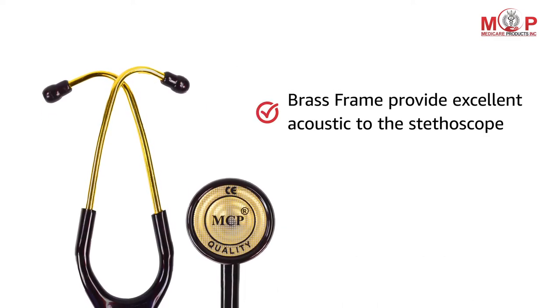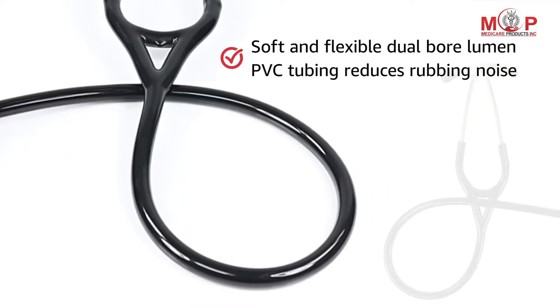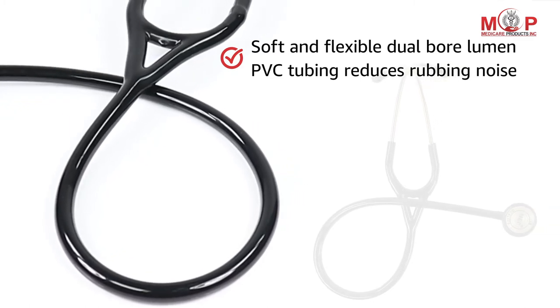The brass frame of this stethoscope makes it light in weight and provides good acoustics. The soft and flexible dual-bore lumen PVC tubing reduces rubbing noise.